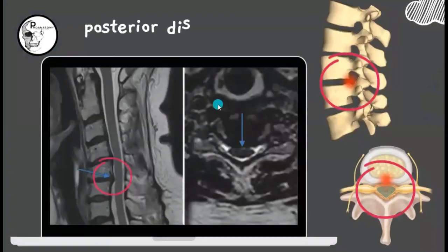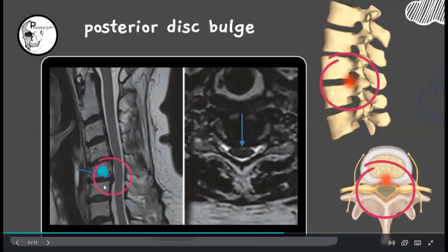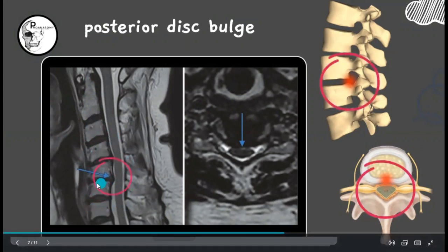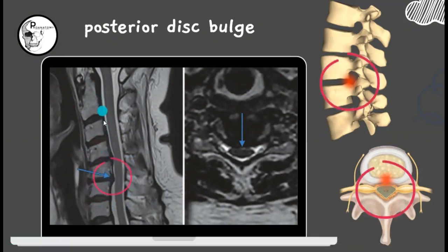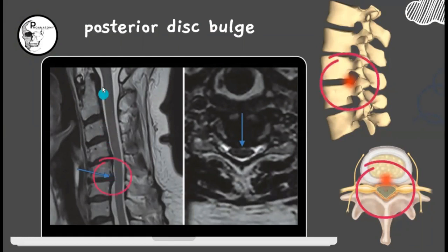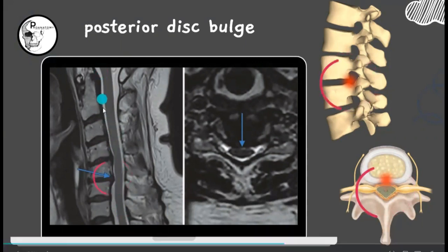Here is a sagittal MRI section showing the cervical vertebrae. The darkened areas are the intervertebral discs. In this red marked area you can see the disc is not limited to its outline — it is slightly projecting backwards. That is the protrusion or posterior disc bulge at the level of C5-C6, protruding into the thecal sac, particularly the ventral thecal sac. The central darker structure is the spinal cord and the outer covering is the thecal sac.